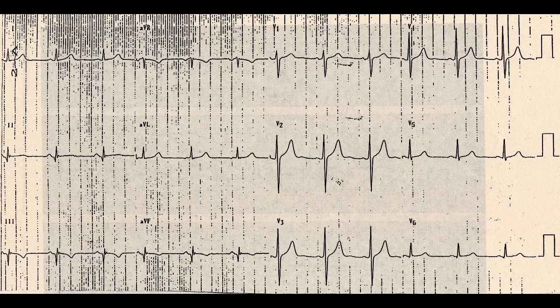And what it means is if the patient produces 1 millivolt of electrical activity through their conduction system, you'll get a 10 millimeter deflection. It's just set that way, 10 small boxes up and down. And it's also called the height or amplitude. So if the person produces, say, less than that, say half a millivolt, then you'll get a deflection that's less than 10 millimeters. In that example, just a 5 millimeter deflection, like that. So the machine is kind of gauging how big the EKG is.